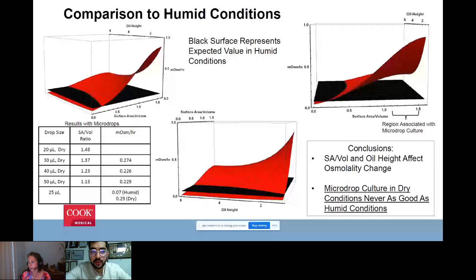Can I just interrupt you here? Yes, of course. When the osmolality changes, so this is for the audience here, are there any changes in the embryos that an embryologist can see and then change the media at an appropriate time before it's too late? How would the embryo behave in such a scenario? Would it just die, or are there subtle changes that can be noticed early on?